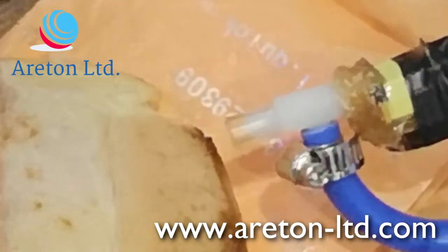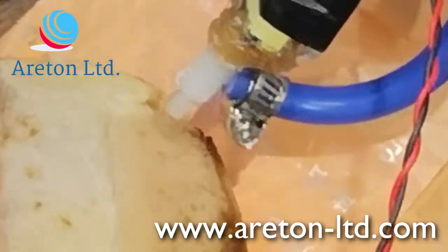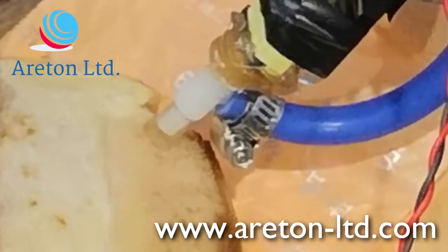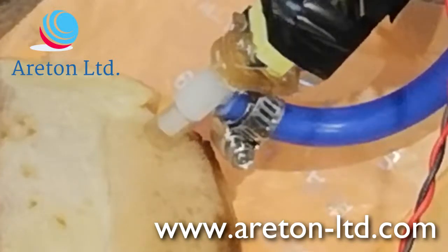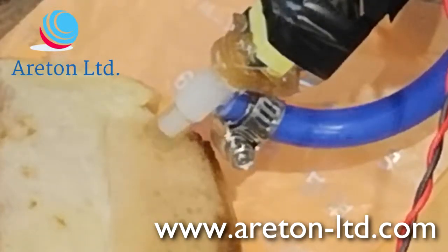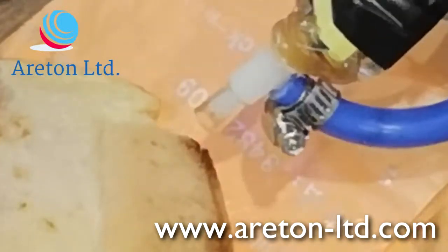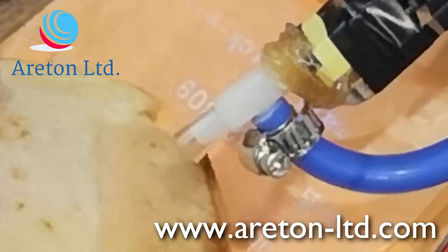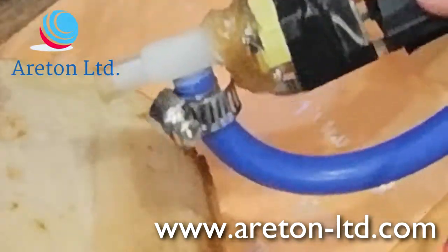Okay, now I'm going to switch off the argon flow and see whether I can actually get the arc here if I get it butted up onto the chicken. But basically there's still a bit of argon in there, so the arcing takes place quite easily. I'm going to do it again without argon now, to see whether it does. And that stopped. We'll do it again. And it stops. So I managed to do it 3 times within a hold time of 900 milliseconds. I'm going to do it one last time. That's it.